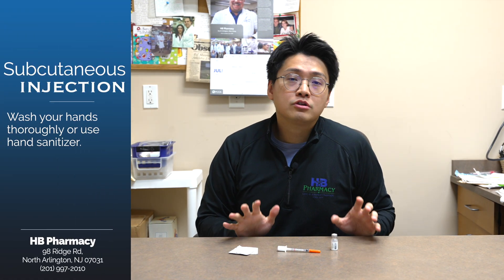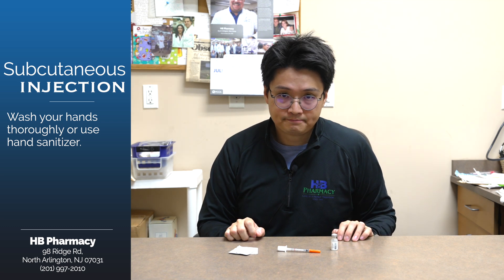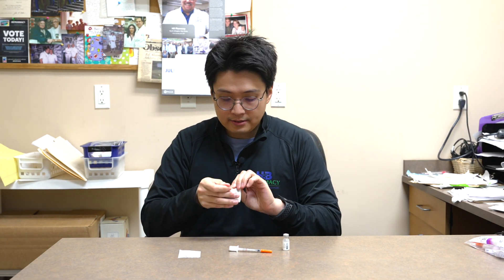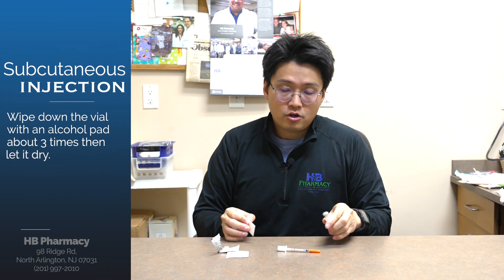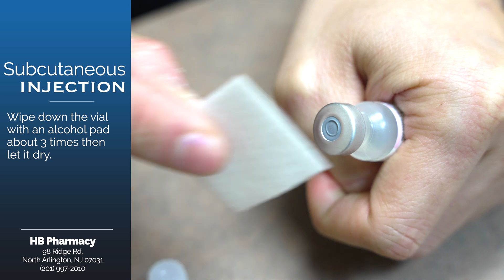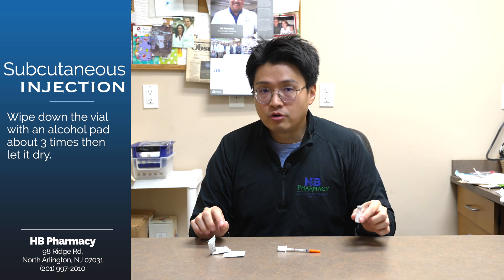First thing first, before you give yourself an injection, make sure you wash your hands very thoroughly. Then, get an alcohol pad and wipe down the vial in the same direction about three times. Make sure you let the vial dry up a little bit.